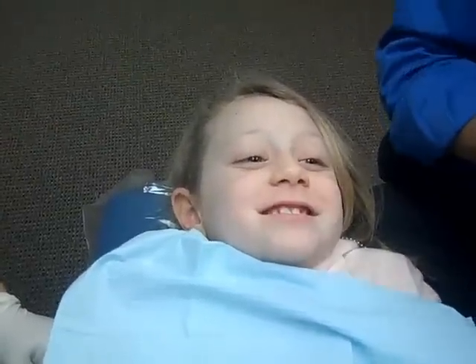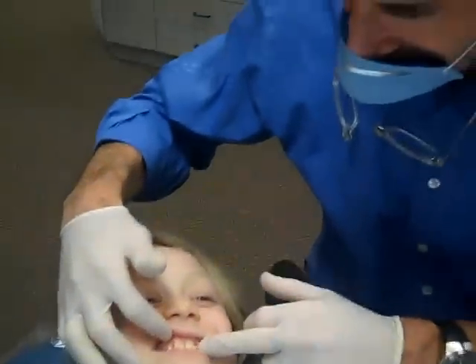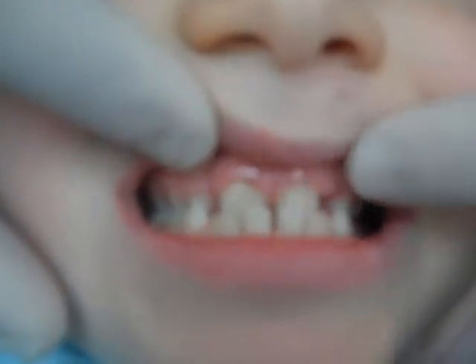Today we're here with Logan, and she's kind enough to show us how we're going to put what's called a bonded expander in with a face mask. Logan, you're just going to show us your bite. She has what's called an underbite, where the upper teeth go behind the lower teeth, and that's exactly why she's going to be in this appliance today.